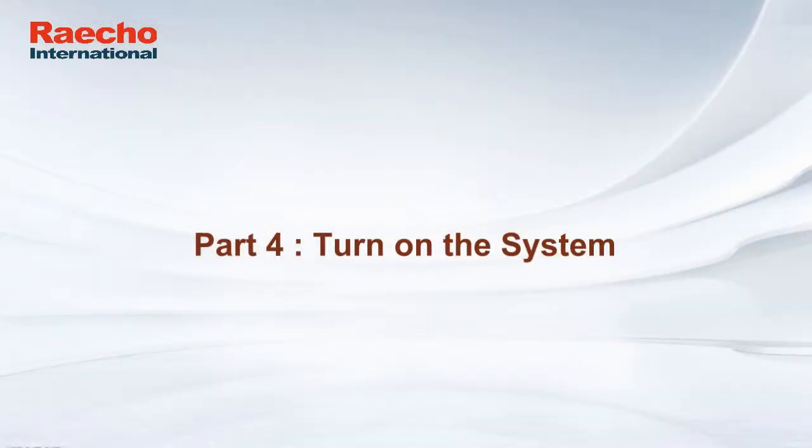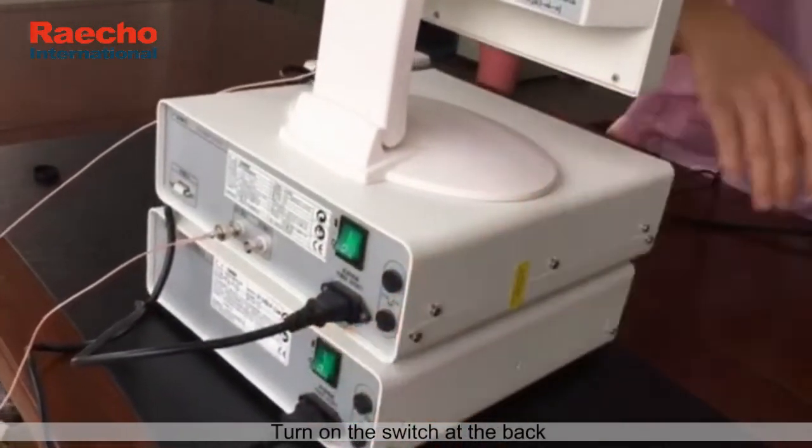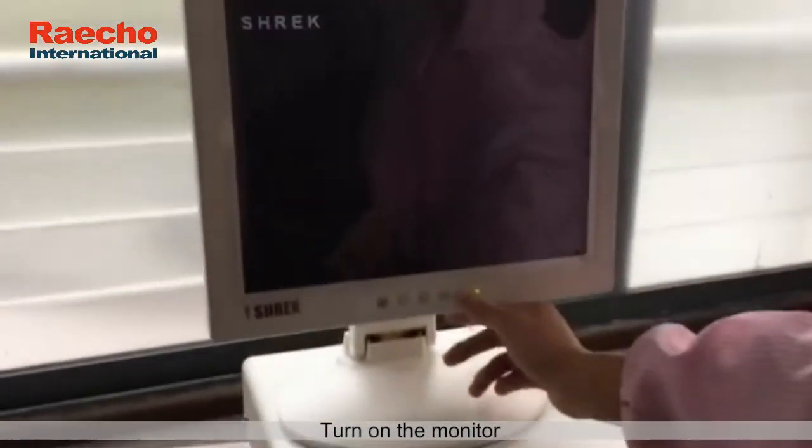Part 4: turn on the system. Turn on the switch at the back, then press the on key at the front. Turn on the monitor.